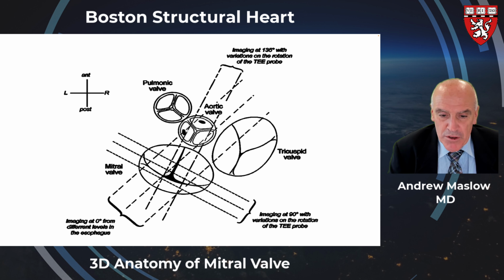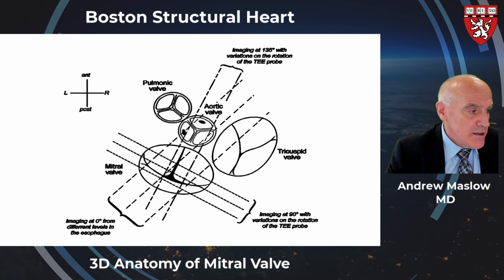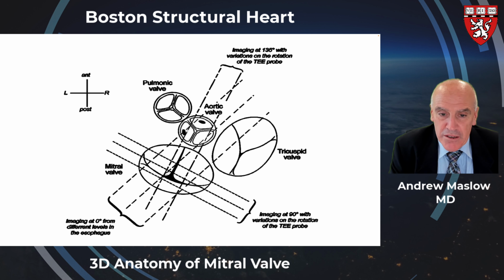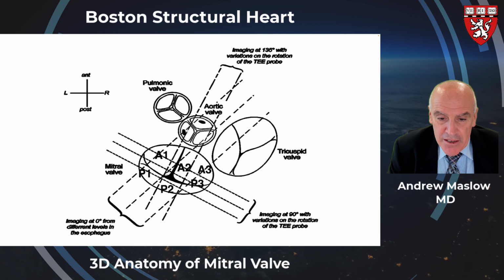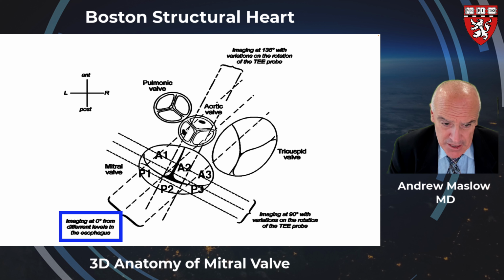As you're seeing a bit more of the tricuspid valve, perhaps you are a little bit more posterior medial on the mitral valve, perhaps seeing the left coronary and right coronary cusp of the aortic valve. You might be towards the middle of the mitral valve, or more anterolaterally. One thing that's apparent is that while the scallops may or may not seem obvious, depending on how you place the probe, in this case here, advancing the probe up and down, you can come across different scallops as seen by the lines.